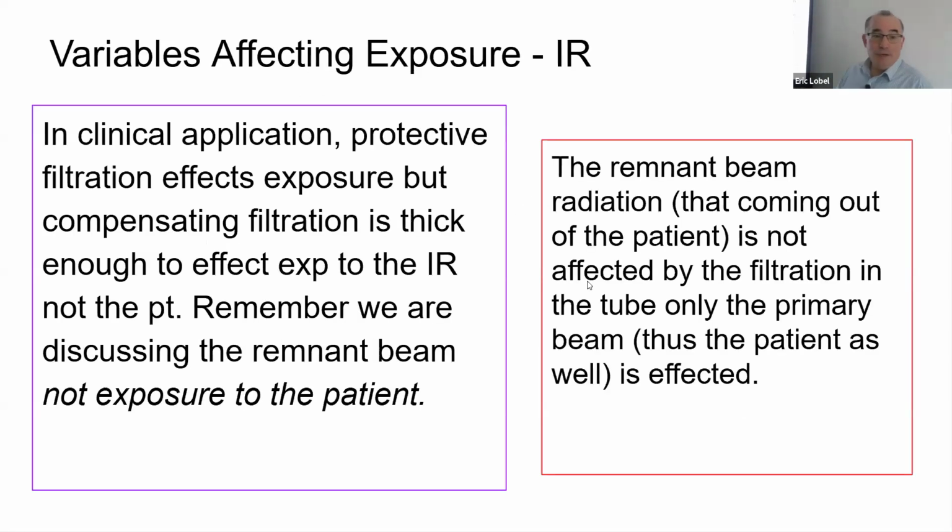Okay, so filtration. What's it do to the beam? What's it do for the patient? Anyone? Short answer test, explain filtration. Okay, so from what I'm hearing, we're getting rid of some of the radiation.